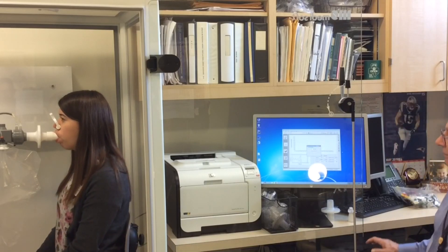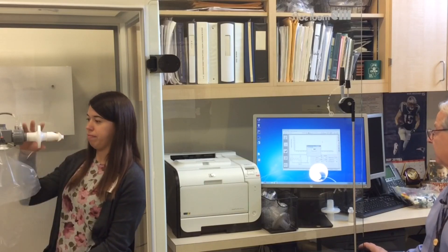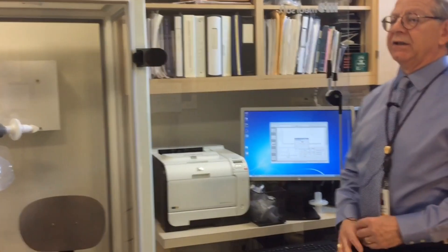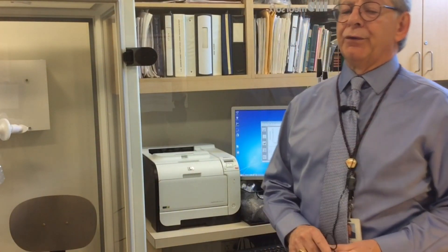And that's that. We did a good job. You can disconnect and you can actually get out of the box if you'd like. So this test will take approximately two minutes to analyze. And then we would repeat that again as well just to confirm what we got on the first test and to make sure that our numbers are accurate.